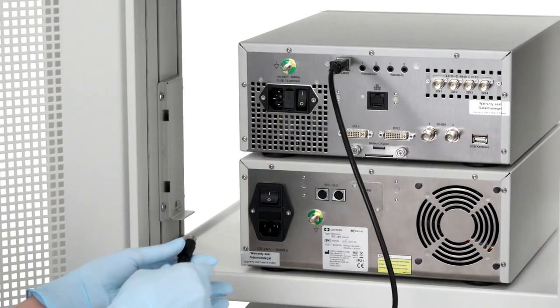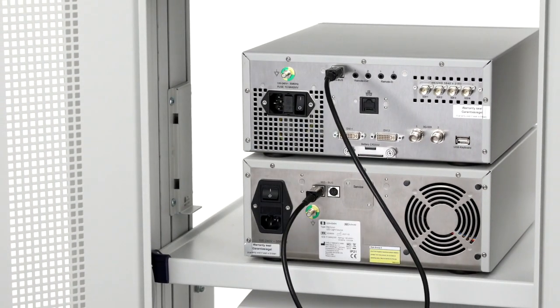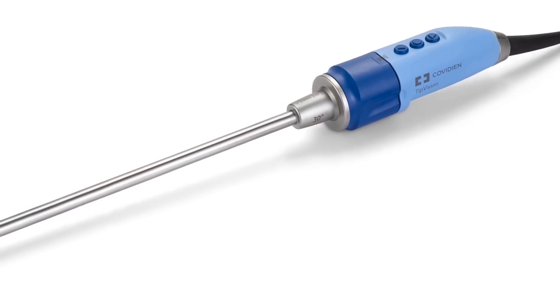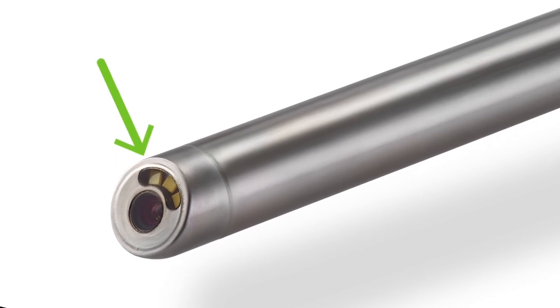This allows you to control the light source using the camera head as well as activating the auto light control function. When using the TipVision video scope, an additional light source is not needed as it has integrated LED lights at the tip of the scope.